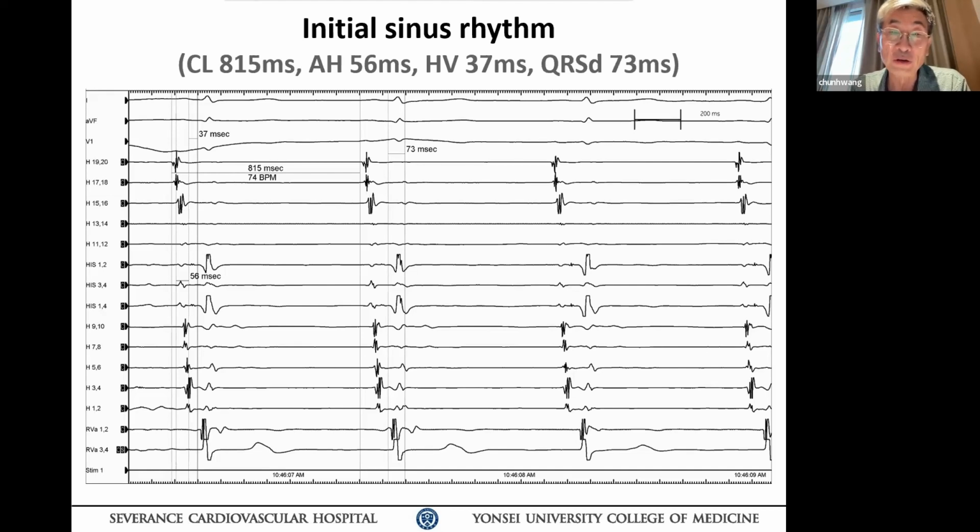In this case, it probably won't matter too much, but if you want a differential diagnosis, probably not to put it there. I would suggest you look at the article written by Dr. Melvin Scheinman, talking about RV catheter positioning for differential diagnosis among the SVTs. Okay, there's a paper written for that. If you don't find it, let me know. I'll give you a paper. All right, let's go down.